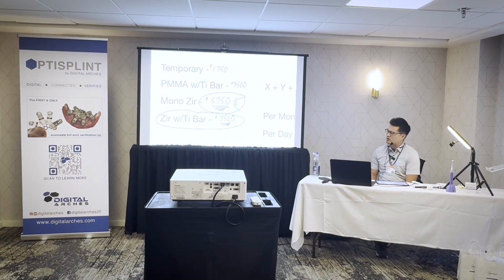The only time I use a zirconia with tie bar is if it's a case where I have more than one tooth cantilever, or limited restorative space, or if it's a zygoma case or a pterygoid case. For all those, usually I do a tie bar. But everything else, everything that has 15 millimeters of restorative space and less than 1 molar cantilever, those are going to be zirconia.